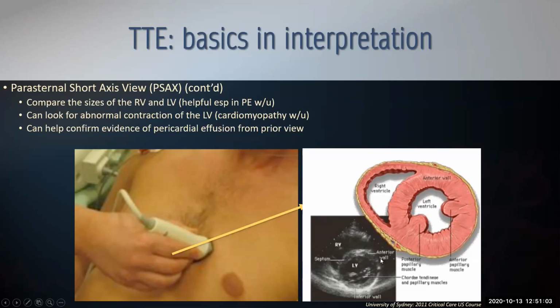Maybe you're looking for a pulmonary hypertension patient. Do we have the cardio probe? Not that I know of. I know Dr. Duffy is trying to work on that to get us a cardio probe. Dr. Braden also has the butterfly, which I think is a better probe for being able to see the heart, but you have to check it out through her. So she has that, I think, in her office if you want to use the cardio specific probe.